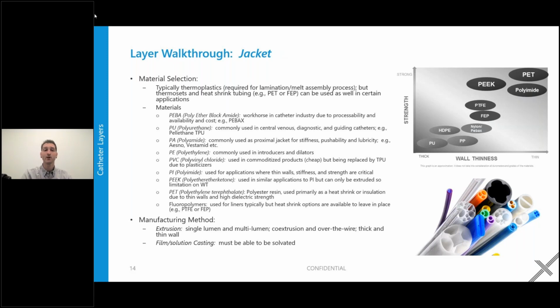But there are various grades of polyurethane, and a lot of them are better performing than PEBAX is. They'll have a better flexural rigidity to strength ratio. There's some that have some polycarbonates mixed in with them, so they have very good flexibility to strength ratios. And again, once you get below 80A, there's no more PEBAX used in there, and so you're going to have to go to a polyurethane if you want to get softer there.